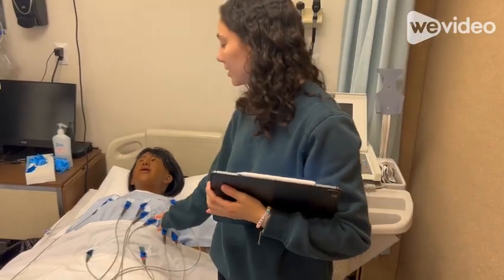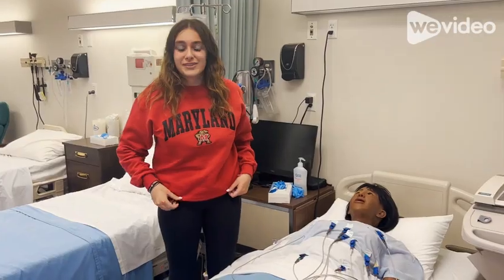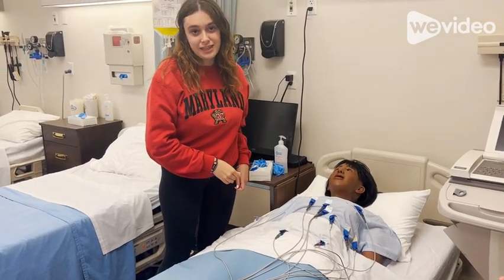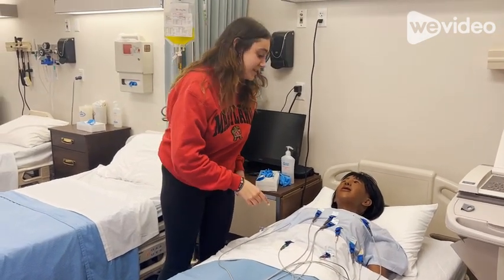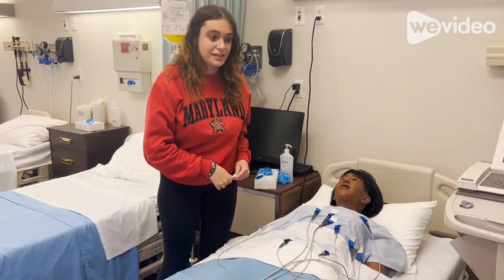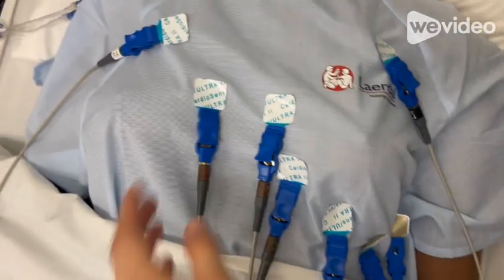Okay, so this is how we would set up the 10 electrodes on the body when taking an EKG. So looking at this, you can see that there are 10 electrodes, but there are not 10 leads. There are actually 12, and this is because certain electrodes are part of 2 pairs, and this provides 2 leads. So there are leads between the left leg and the right arm, and the right arm and left arm.